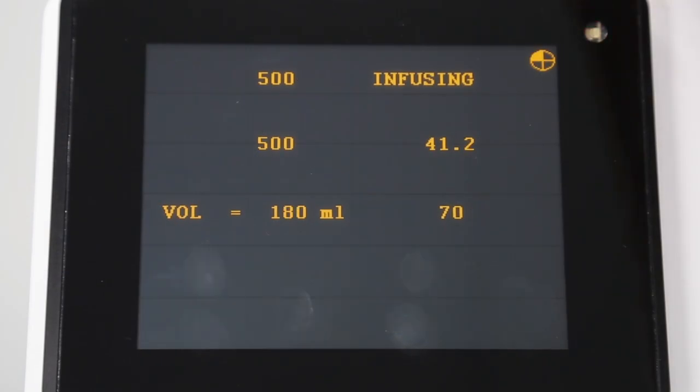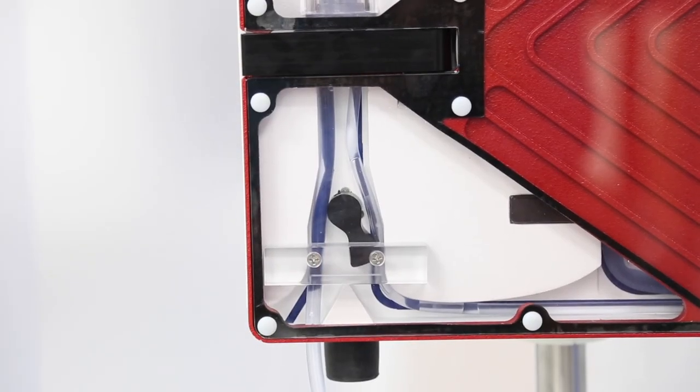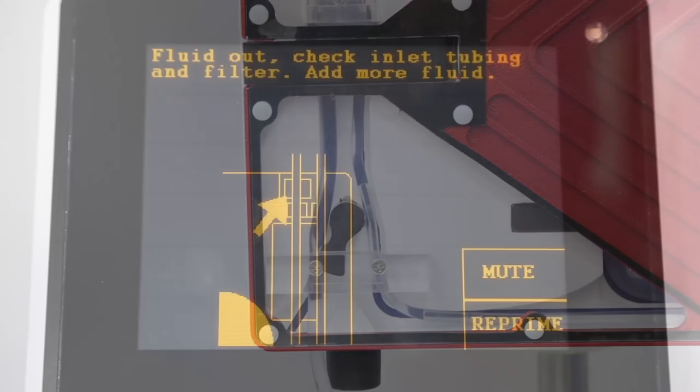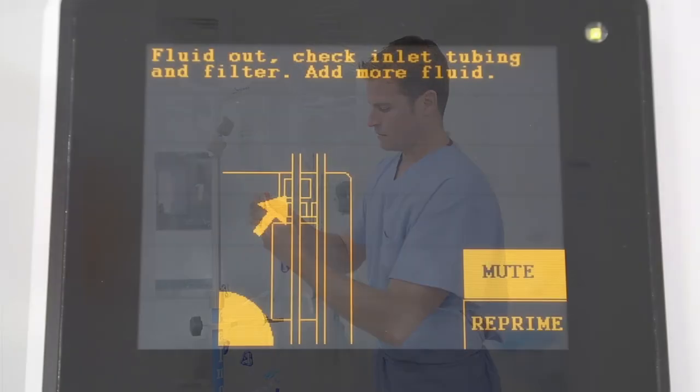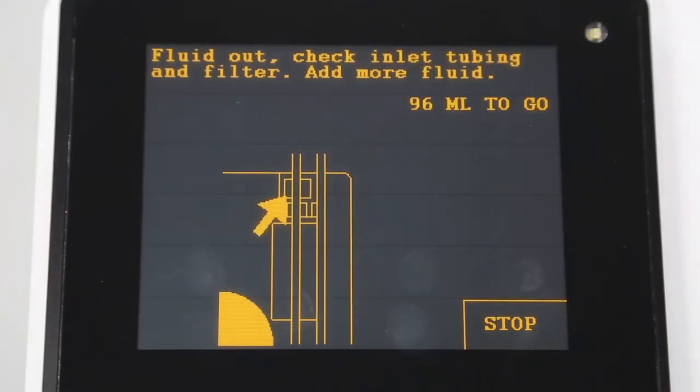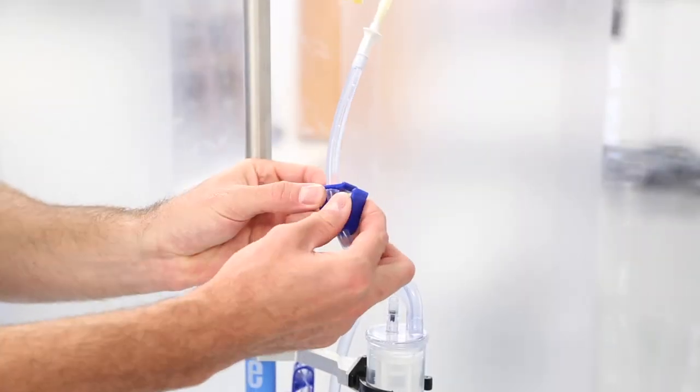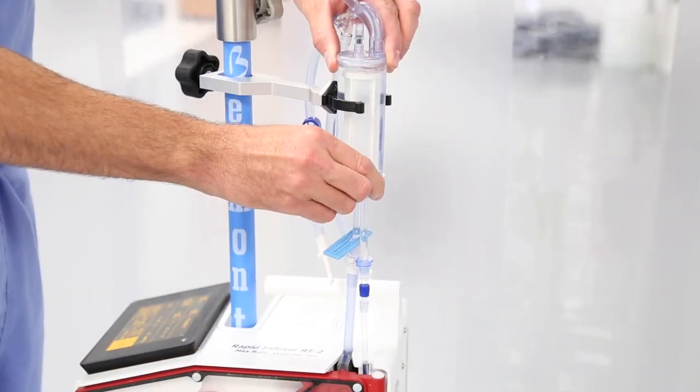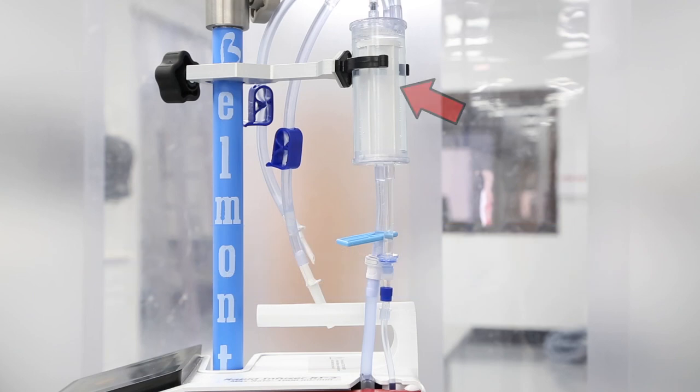A fluid out alarm will occur if the operator allows the system to run out of fluid. The Belmont will immediately stop infusion and automatically clamp off the patient line. Press mute to silence the alarm, add fluids, and press reprime. The system will automatically reprime in 13 seconds. If the fluid bags are not empty, check to make sure they are properly spiked, clamps are open, and the tubing is installed correctly. High amounts of particulates in the blood may clog the coarse blood filter in the reservoir chamber. Replace the reservoir chamber or disposable if it becomes clogged.